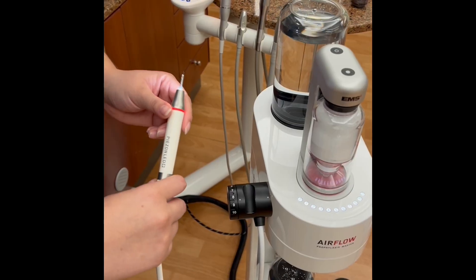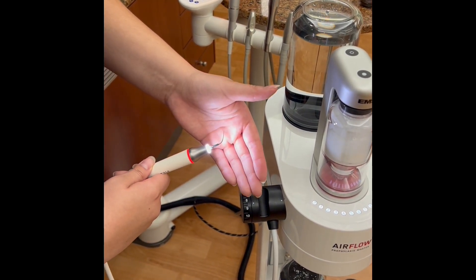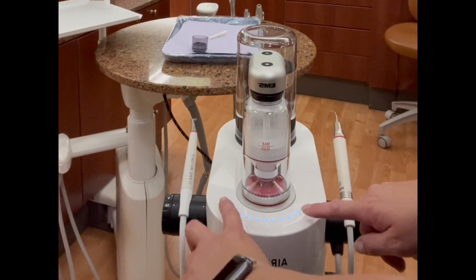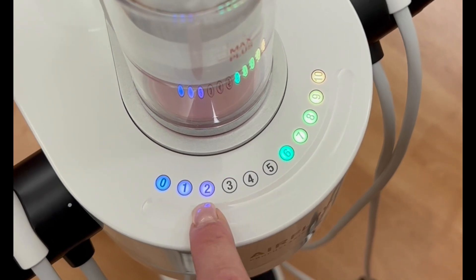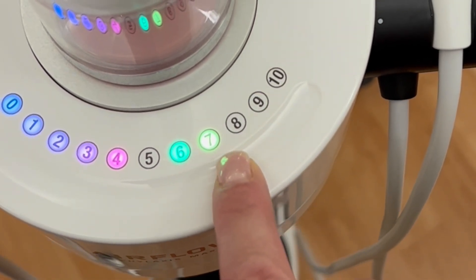Our clinic has the PS, or straight PerioSlim instrument. The power setting for the PS should range from 3 to 10 depending on the amount of calculus and biofilm. The water temperature and volume levels can also be adjusted by tapping the 0 and 10 at the same time on the touch screen — 0 to 4 adjusts the water temperature, and 6 to 10 adjusts the volume.